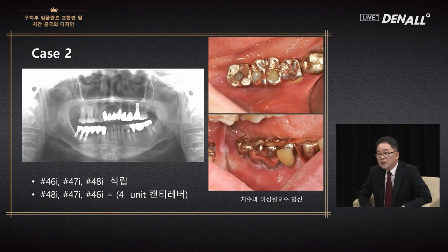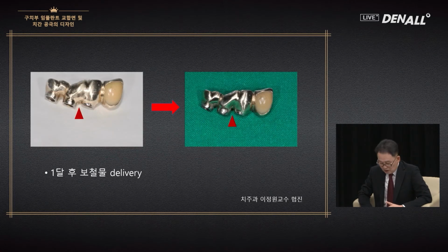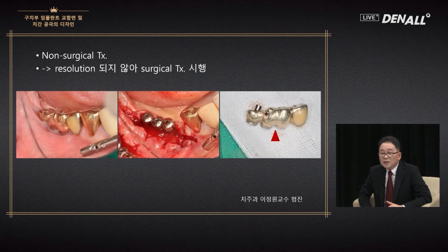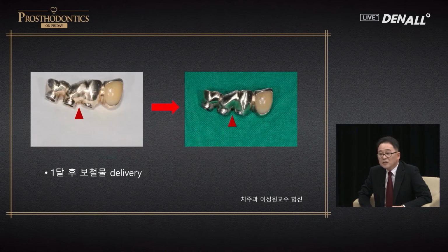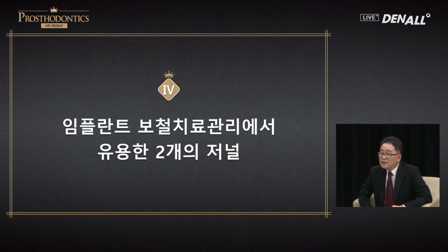Embrasure space. The implants are very close to each other. If the middle one is not restored, it could have been better. So things didn't improve, and at 19 months, we decided to remove it. After we place implants, sometimes we are too scared to remove the implant placed.